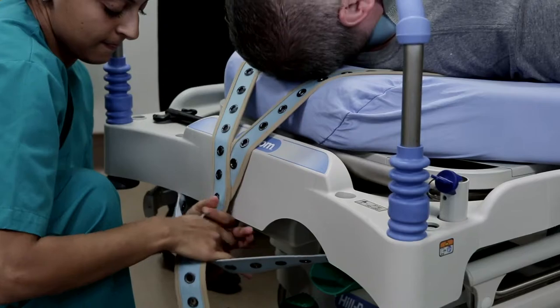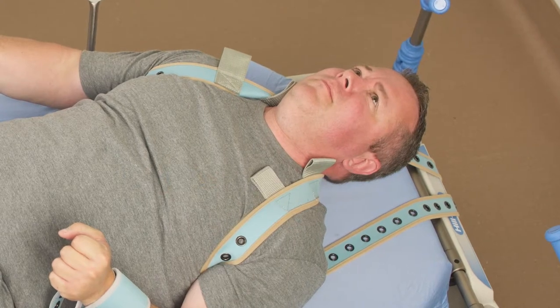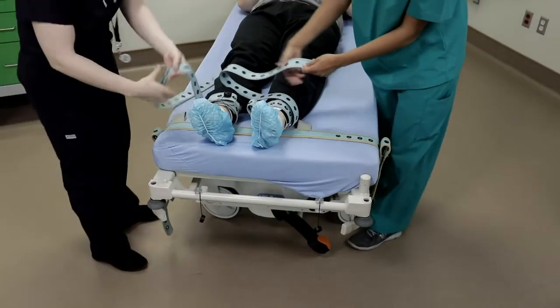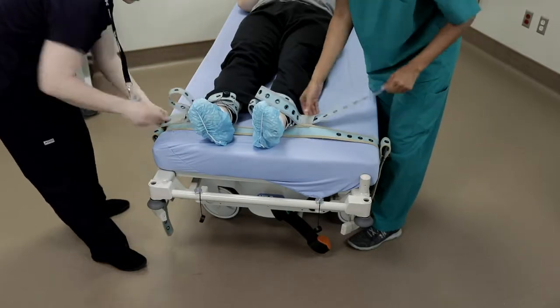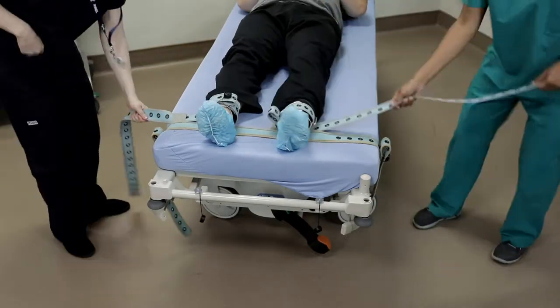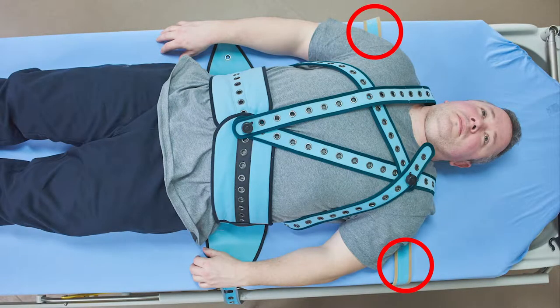When placed over the patient's shoulders, it dissipates their energy and aggression quickly, yet it is comfortable for the patient. The large utility belt can also be used to control the leg movements of the patient. It primarily acts as a pivot point for the limb belts attached to the patient's legs. The large utility strap is passed under the straps of the shoulder strap to keep the shoulder strap secure to the mattress.